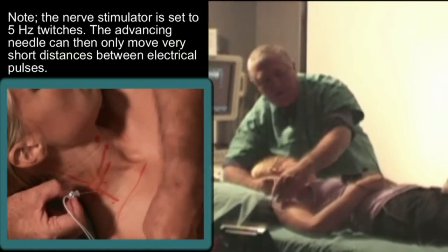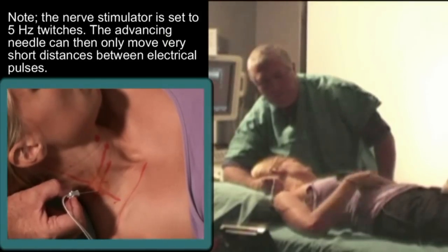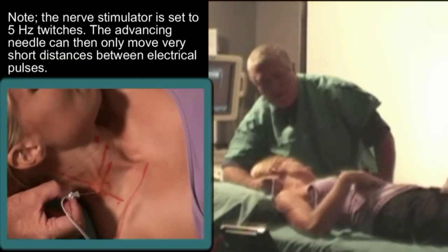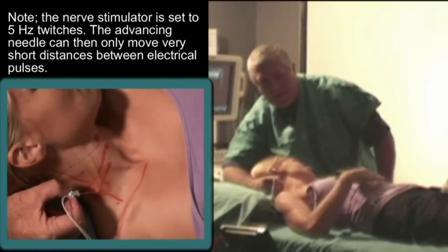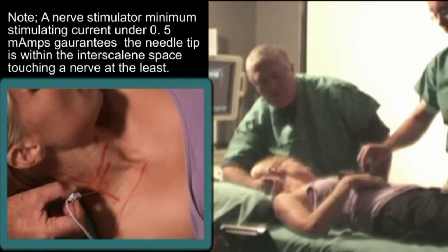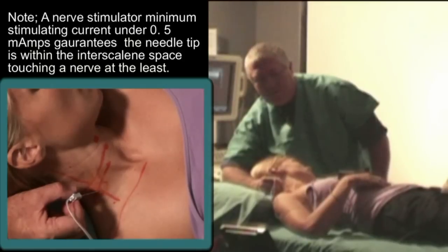We've got a deltoid twitch here at 1.9 mA. I went straight into the plexus. Dial it down — okay, 0.4. You definitely want to twitch under 0.5. Any twitch over 0.5, you're potentially on the wrong side of a fascial barrier. Check your drug, get out, and go home.